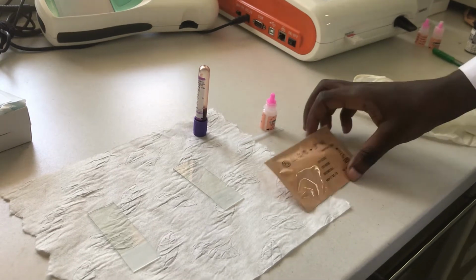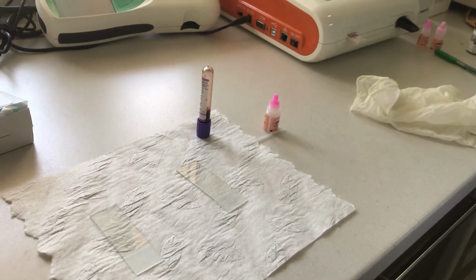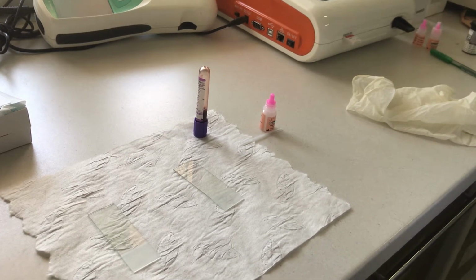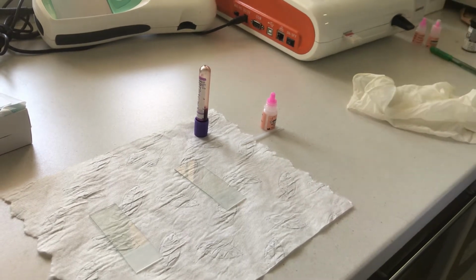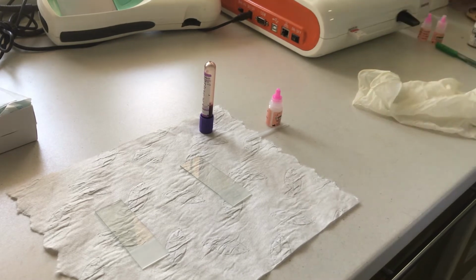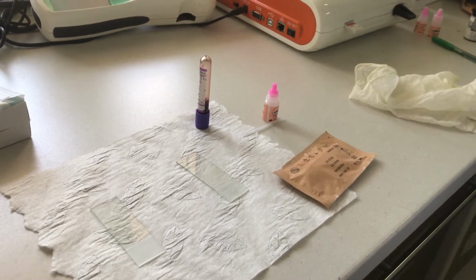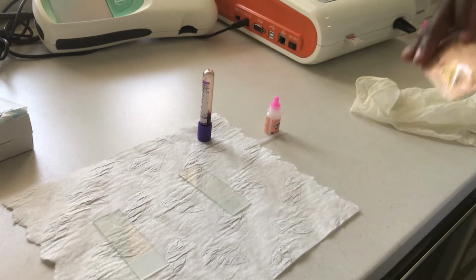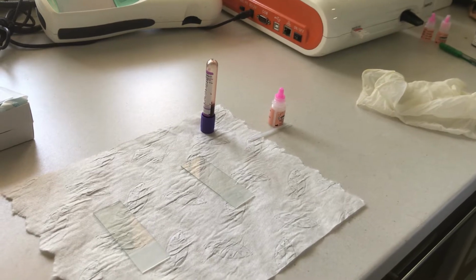So today we want to look at how we diagnose malaria from the laboratory. Malaria infection is caused by a hemoparasite called Plasmodium of various species. But here in Africa, we basically have different techniques we use for diagnosis.